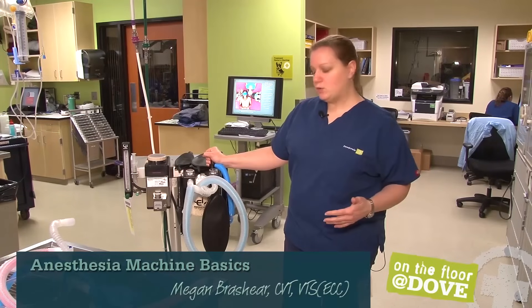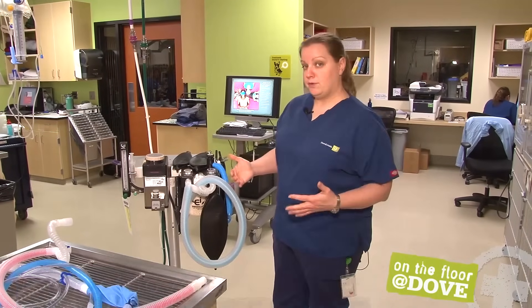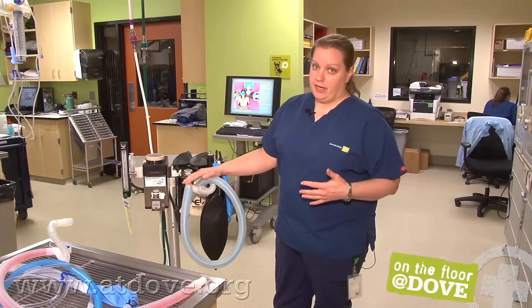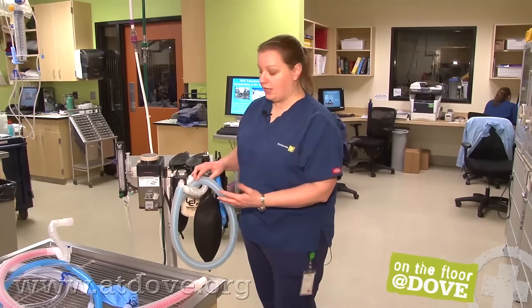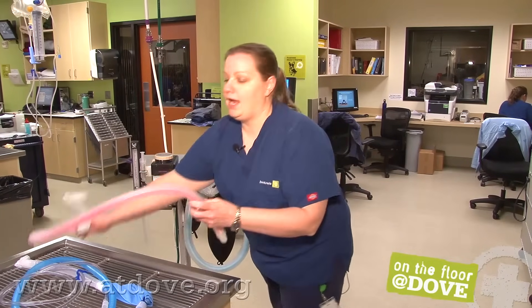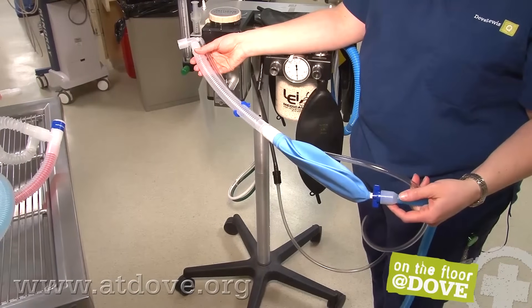A couple things I want to go over. The first is the equipment you're going to use for your patient, which involves your reservoir bag and your anesthetic circuit. First, choose your anesthetic circuit. This one we have currently hooked up to the machine is an adult circuit. Here I have a pediatric circuit, and we also have what's called a non-rebreather.